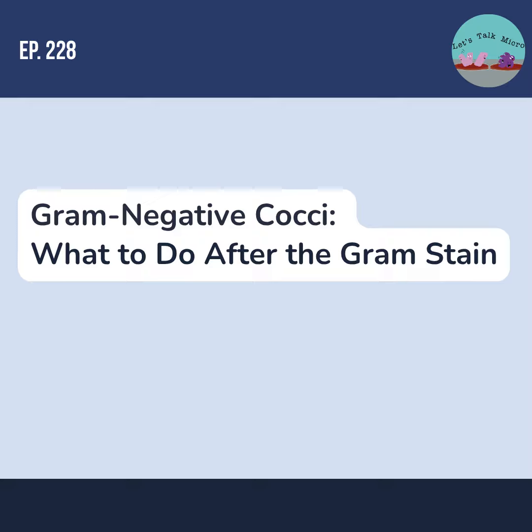As far as transport media, Amies media or a liquid transport media is recommended. And it is definitely recommended for the sample to be transported to the lab as soon as possible. And even though there are studies that show that after refrigeration, Neisseria gonorrhoeae has still been recovered after 24 hours, it is still the recommendation to plate it as soon as possible.